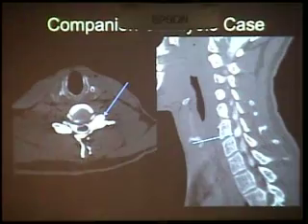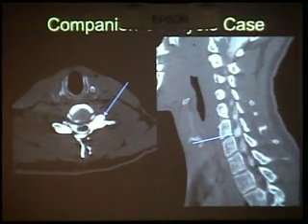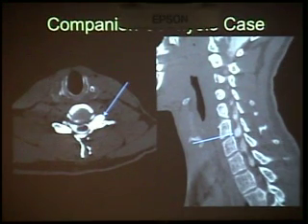And so this is a companion case from a myelogram showing the same thing, a pseudomeningocele. And if you look kind of hard, you can see the contrast bathing this less dense, linear structure. That's the nerve, and if you scrolled through this, there was no nerve coming through it. So then you know that nerve root has been sheared. So that's what you're looking for if you're looking for a pseudomeningocele and preganglionic injury. This nerve root has gotten torn off the cord.